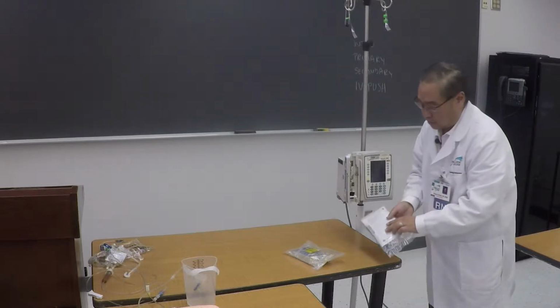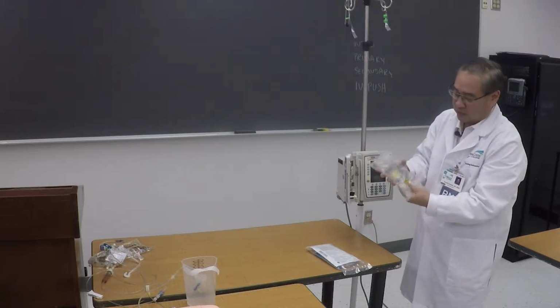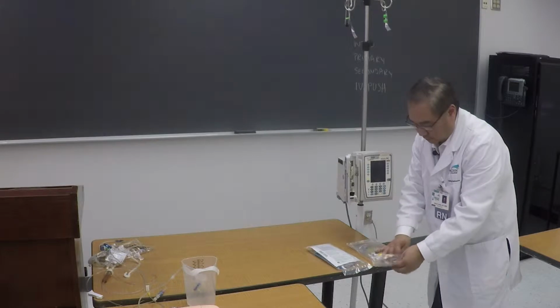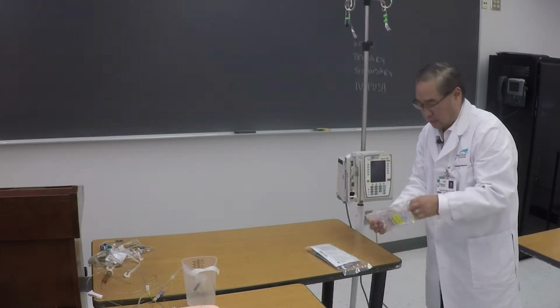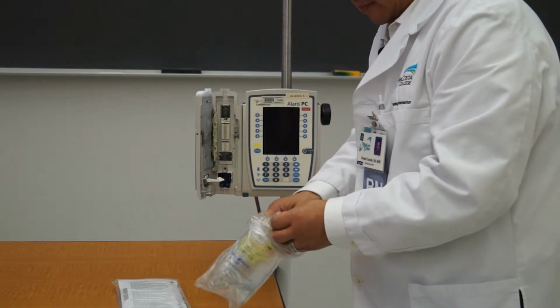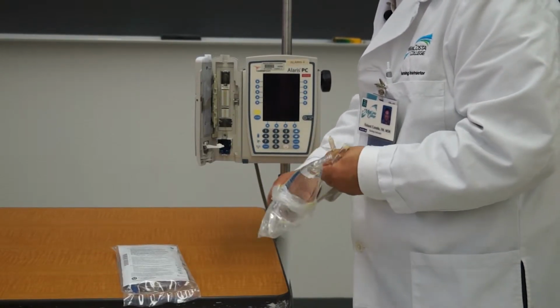In this case, you're going to take your package, the primary IV, inspect the package, and make sure that it's not expired, that there's no rips or tears in it. I will then open the package up, remove the actual infusion bag, and inspect it for any tears. There are times when you open up the bags and inside you'll find a tear or a rip or a leak.